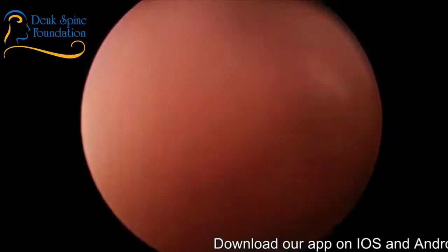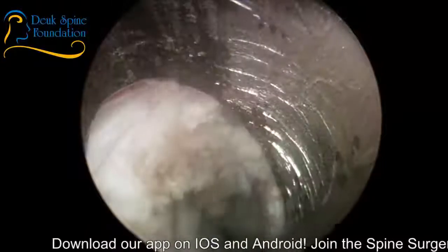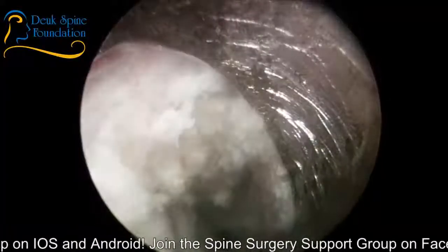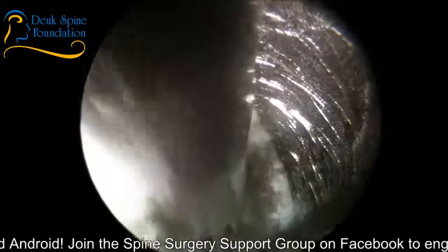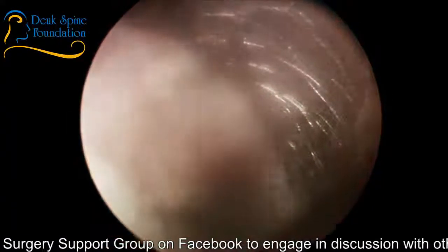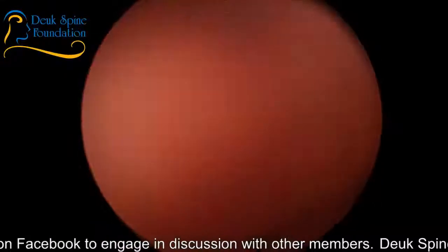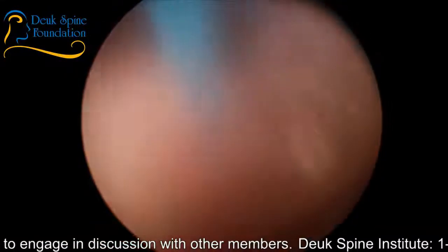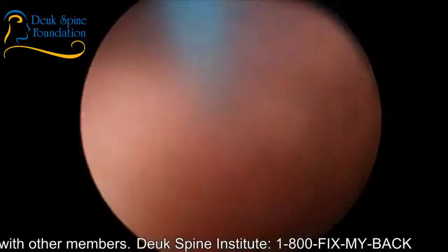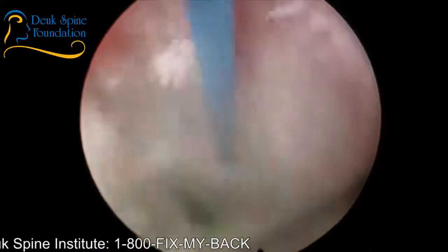Stand by. I'm reaching up in there and trying to pull out any more herniation I can get. My grabber around. That's pretty good. Give me that laser. So what's bleeding is we've decompressed the nerve root, and those are just epidural veins that are starting to bleed. Because the root is now well decompressed, I feel pretty good about it. I'm going to wrap this up in the next minute and we'll get the next herniation done. I think we've done everything I can do here.